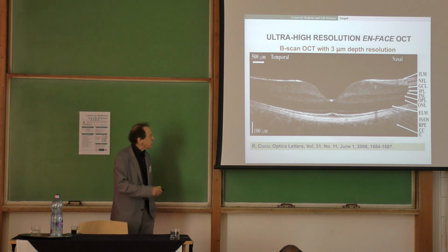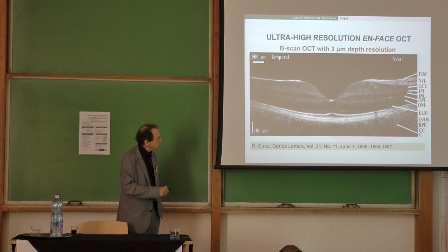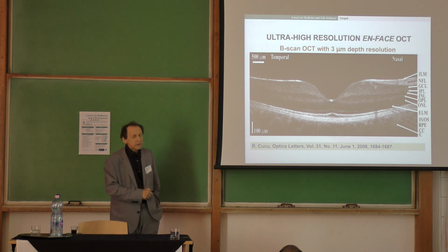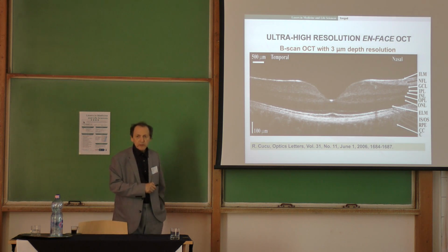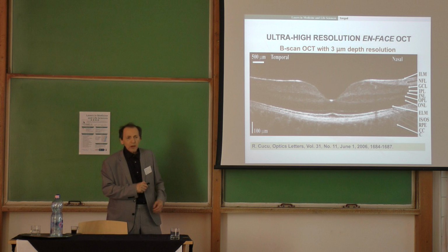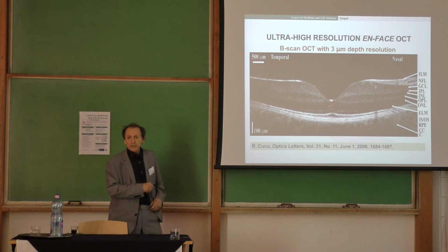And ophthalmologists, now they know what to do with all these layers. All those acronyms, they know what they mean. And generally, disease comes here in the central part of the eye. We call this central part of the eye fovea. The photoreceptors are somewhere here. And bad things happen in those cases which we refer to age-related macular degeneration. This is a degeneration of the macula.